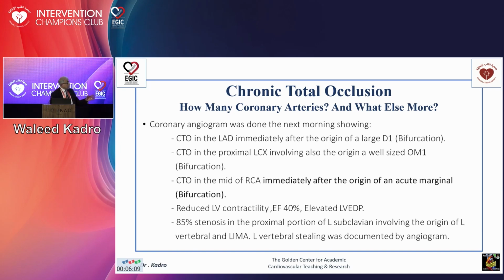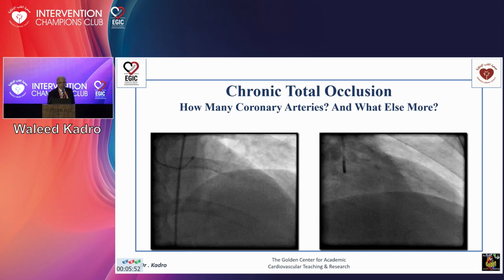So this is a patient who is in denial, escaping everything, and so we have to bring him to the cath lab and not consider the option of CABG, just do ad hoc complex intervention for that. So let's review his angiogram.